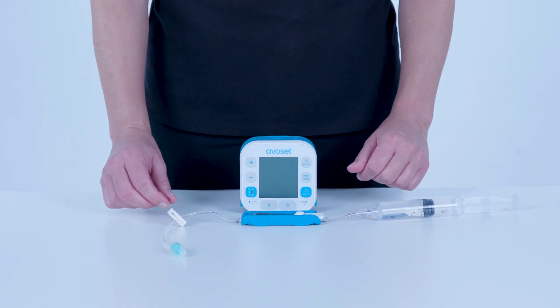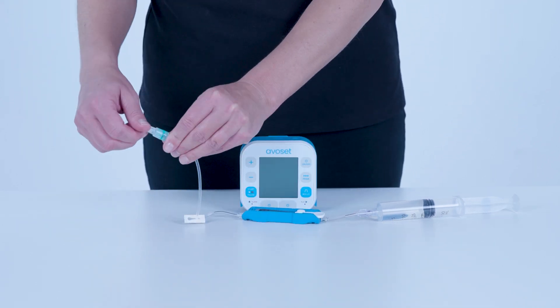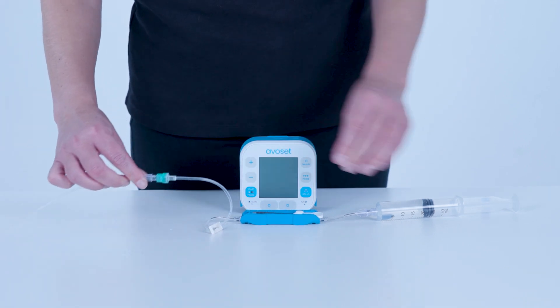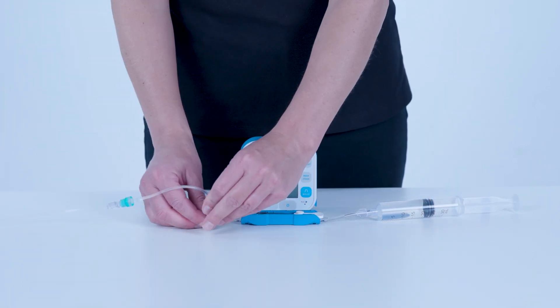If priming a syringe set, remove the end cap and connect an extension set. Open the clamp and remove the white release clip.